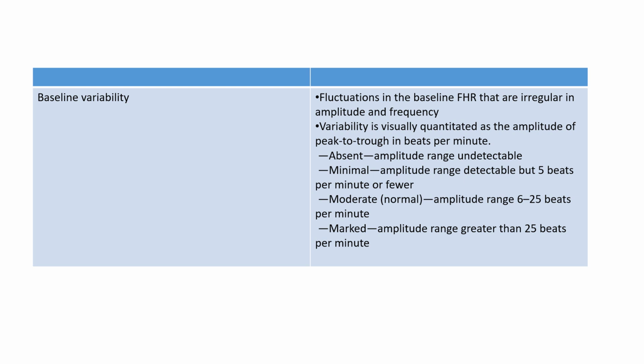That's also explained by the domination of the parasympathetic and the sympathetic immature centers of the brain of the fetus. Minimal and absent are abnormal. Marked is also abnormal.